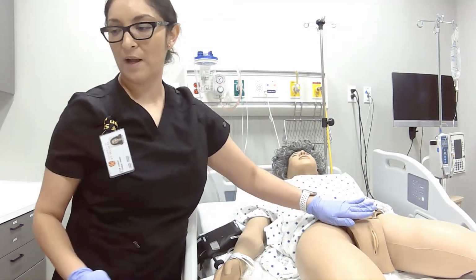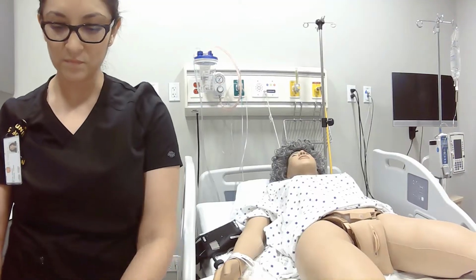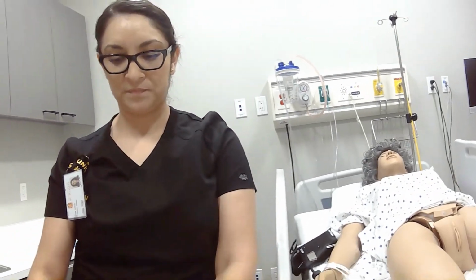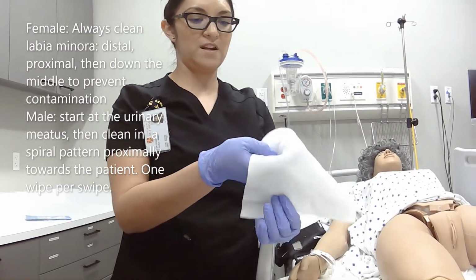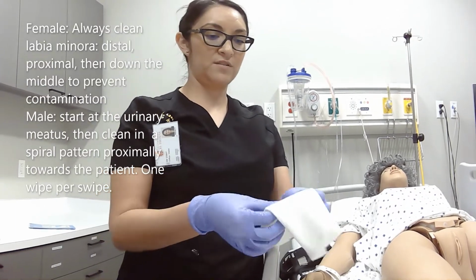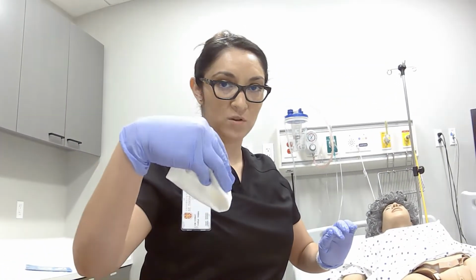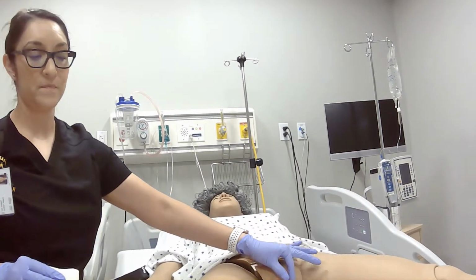So, we will go ahead and get our bath wipes, and you're going to do one wipe per swipe. So the way we're going to clean our patient, okay, so I'm just going to grab the wipes like this, okay, so I'm going to use my dominant hand to hold the wipe, and the non-dominant hand I'm going to use to hold that labia open, okay?